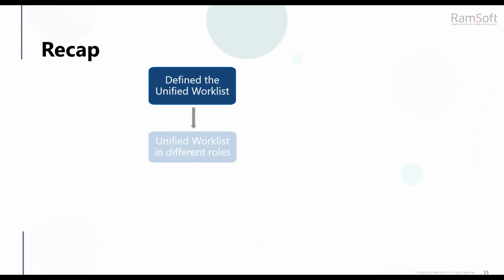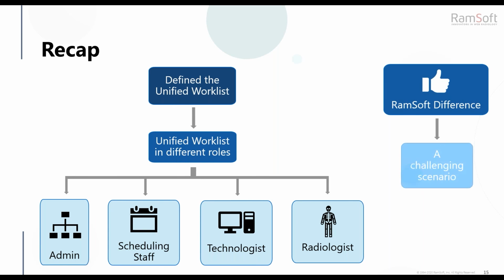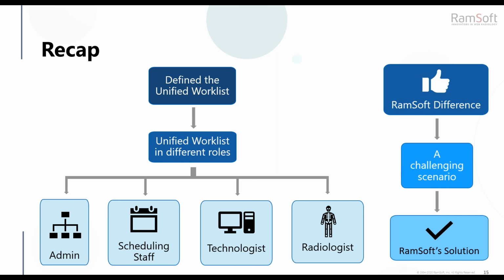So in today's rather brief presentation, we've learned what defines a unified work list. We've reviewed how Ramsoft can increase efficiency for a variety of roles, including admins, schedulers, techs, radiologists, and so forth. We also discussed Ramsoft's key differentiators, radiology practices' challenges, and how Ramsoft is able to come to the rescue with our more than 25 years of deploying this technology. So the bottom line is efficiency, right? Ramsoft's incredibly versatile, configurable workflow with unified work lists drives these efficiencies to new heights.